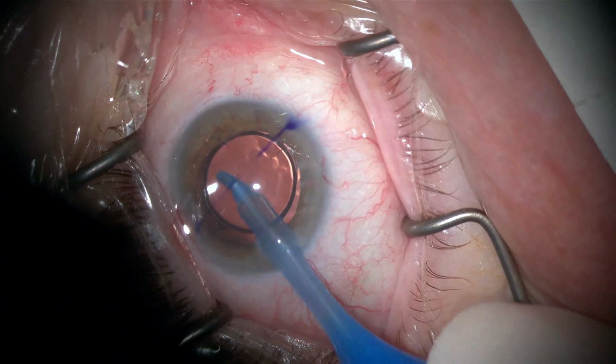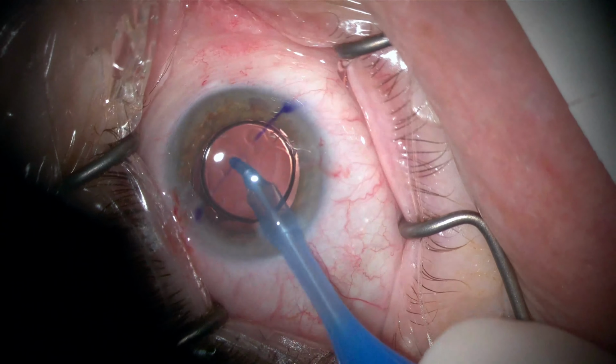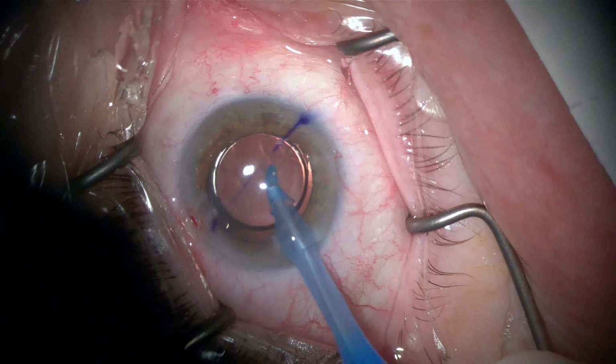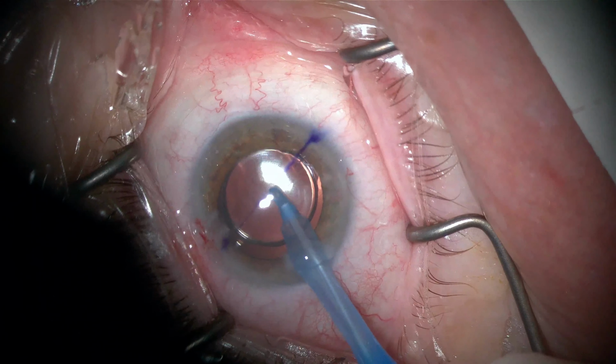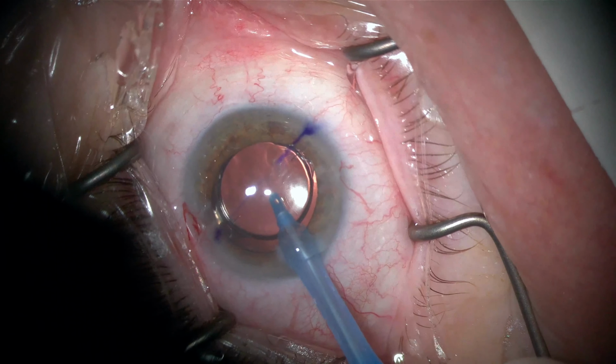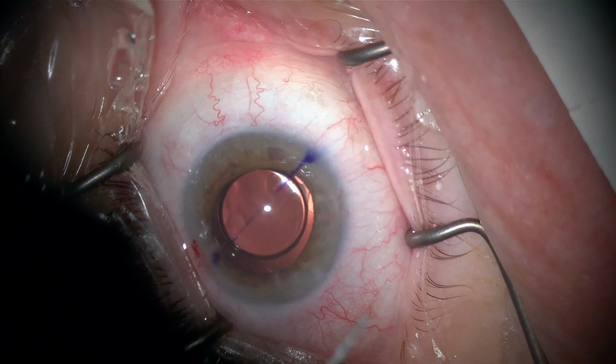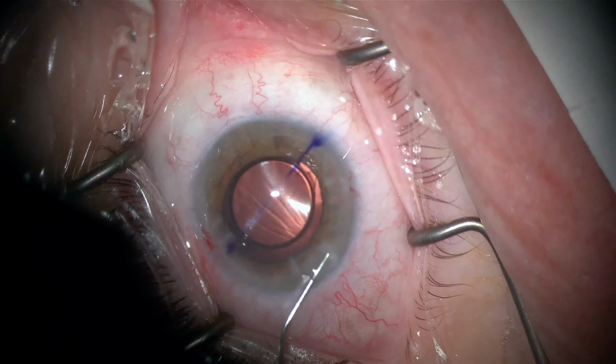And once this is complete, I also like to make sure that the wounds are well sealed and there's no leak from the wound at all, which you should be doing anyway, but I think in these cases it's even more important to prevent any rotation of the IOL.